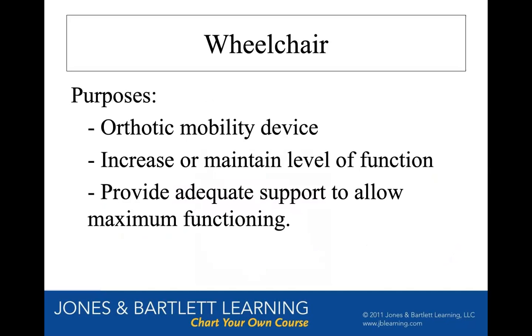Okay, so purposes of a wheelchair, I don't think I really have to tell you this. Besides allowing for mobility if you're not able to walk, it does provide postural support. So sometimes you might see somebody with a certain specialized backrest or a certain lateral component on the chair, which comes out and supports their trunk, so they can stay sitting upright and still function in their everyday activities. And we'll see pictures of those in just a minute.